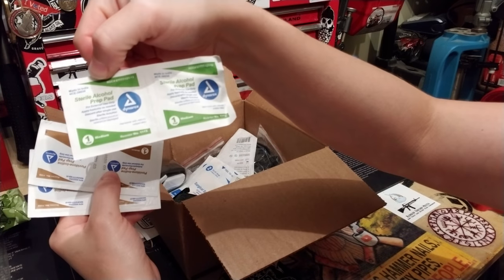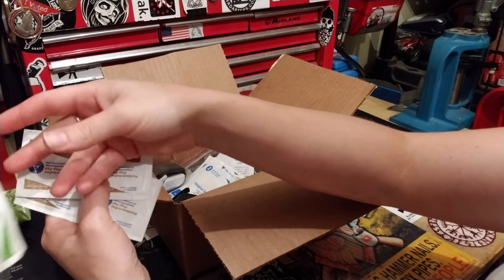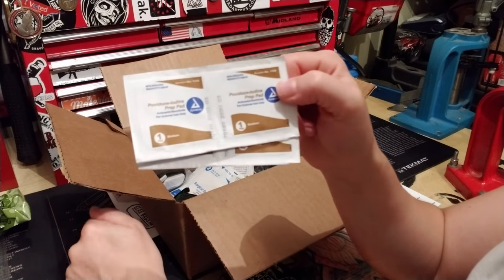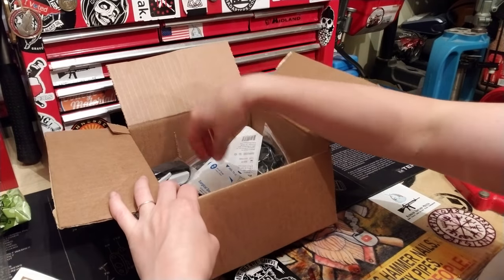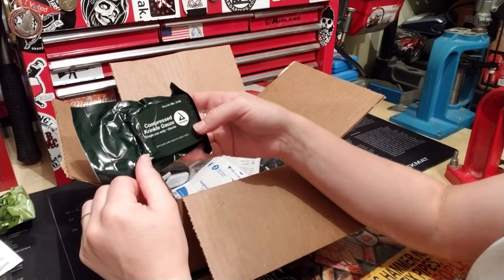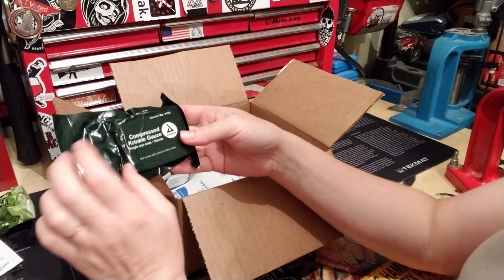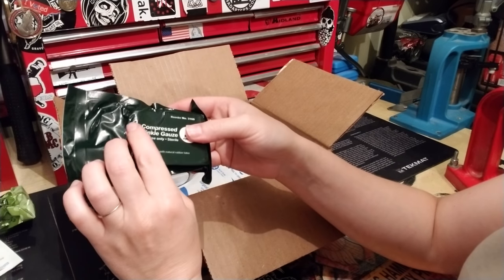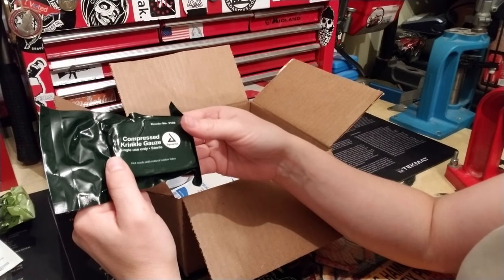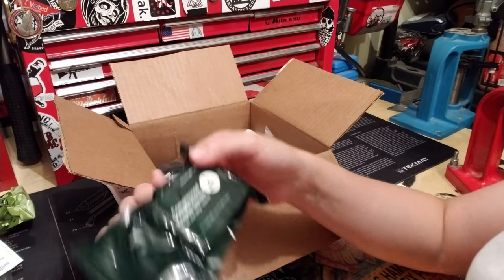There are sterile alcohol prep pads for external use — apply topically and discard after single use. Also povidone iodine prep pads as an antiseptic germicide, external use only. Note these tend to dry out over time. There's also another small Israeli bandage and compressed crinkle gauze — vacuum-sealed and pressed, so there's a lot of gauze packed in there.